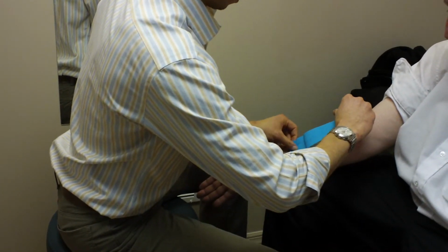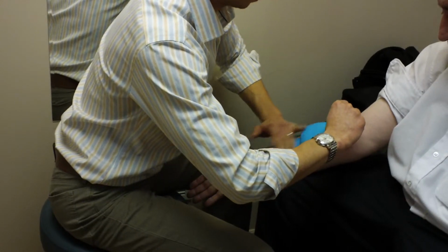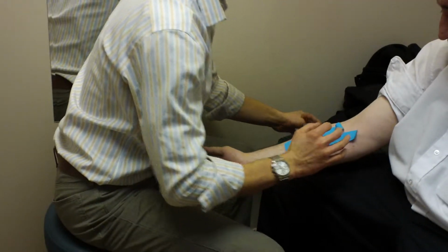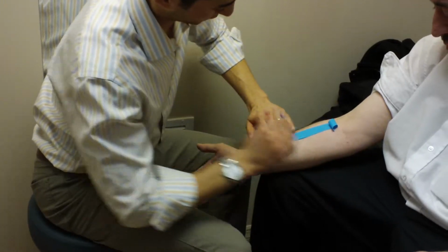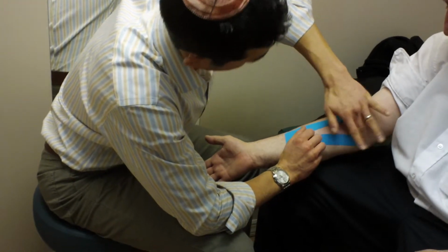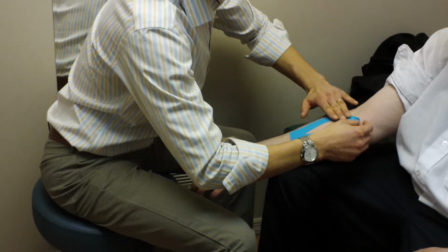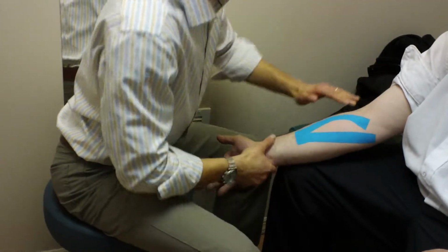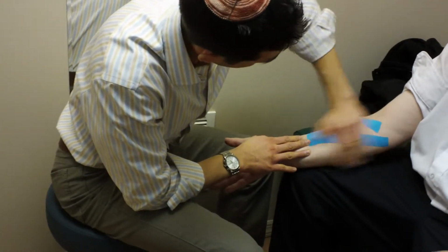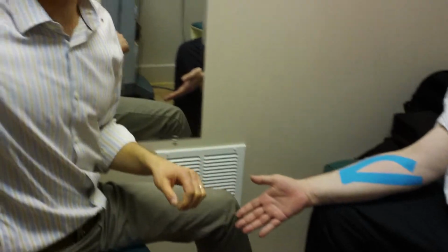So we're going to start about the distal third of the forearm here. We're going to lay down our base. And from here, we're going to take our tape up. At this point, I'm going to use just a little bit of tension, from 0 to 15% of the full elasticity of the tape. And we're going to really surround the muscle belly. There we go. Now from here, I'm just going to let the glue take its hold. Okay, and that's for the flexor carpi radialis muscle.